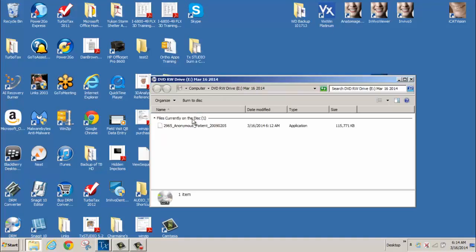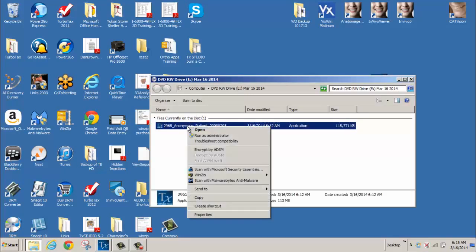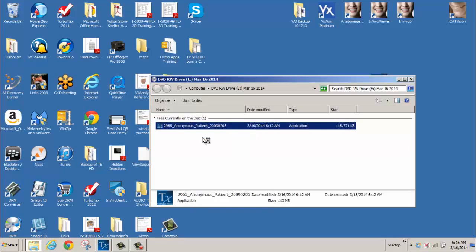Next, double mouse click on the saved file or right mouse click on the file and select Run as Administrator, which may open the case faster. The speed with which a case opens is dependent on the computer and its hardware.